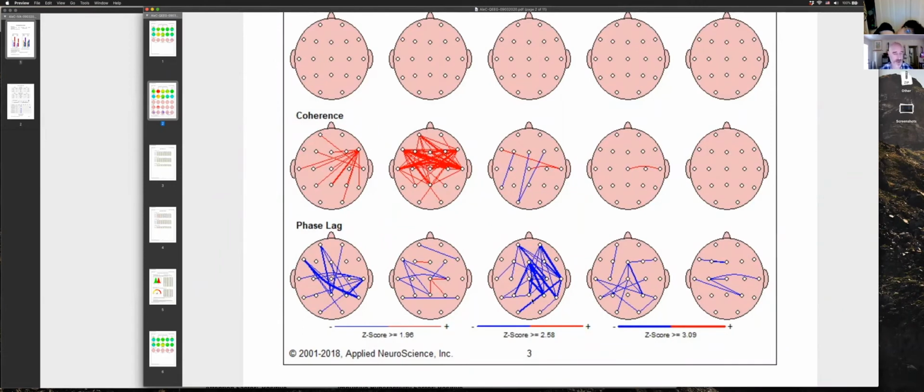But the alpha waves have a low phase lag, which means they're tightly tied together front to back. And usually that means you aren't getting good deep sleep and you're kind of burned out. Not getting good slow wave or dreamless sleep at night. Not enough deep sleep, essentially. Yeah, I have sleep apnea. Well, that makes some sense.